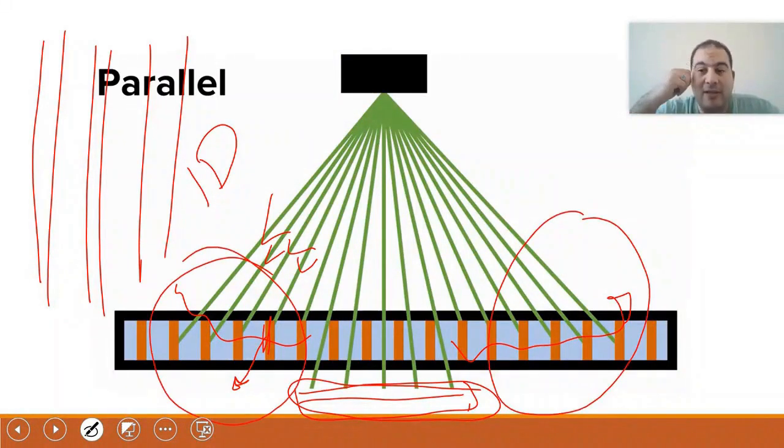What does grid cutoff mean? This refers to something that is not captured in your imaging. This is called grid cutoff. So, you will have errors related to the grid, including errors resulting from the design, like the pattern, for example.